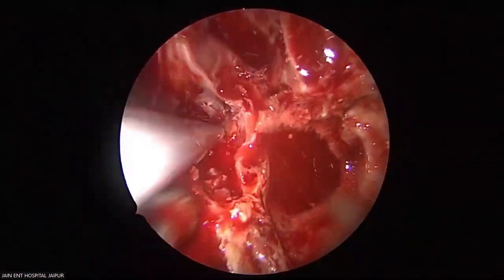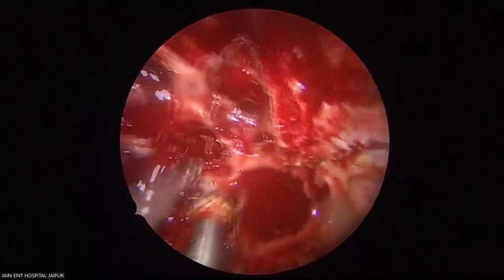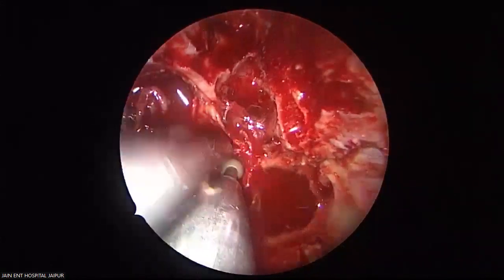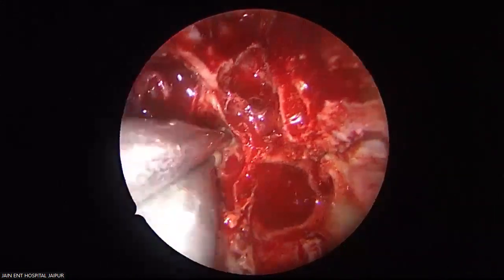See this? Dr. Satish, if you don't have the specialized burr, can you use the fine diamond burr? Yes, you can. But it has to be more controlled.